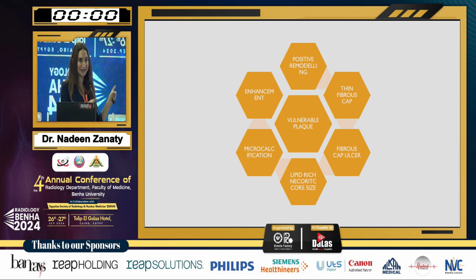دي أهم حاجة هنا عشان نقول للكلينيشن تتدخل وتلحق العيان قبل ما يحصل له ستروك ولا لا، برضه الستيبل ولا لا. أول حاجة الفايبرس كاب thickness هو thin ولا thick ولا fissured. الالسر بتاعت الفايبرس كاب اذا كان ulcered ولا لا. الليبيد ريتش نكروتيك كور لان السايز بتاعه كل ما بيكبر كل ما بيخلي البلاك برون اكتر انها ترابشر. المايكرو كالسيفيكيشن بتعمل شيرنج موفمنت بتخلي البلاك انها ترابشر برضو. واخر حاجه الانهانسمنت والبريزنس اوف هيموريدج.